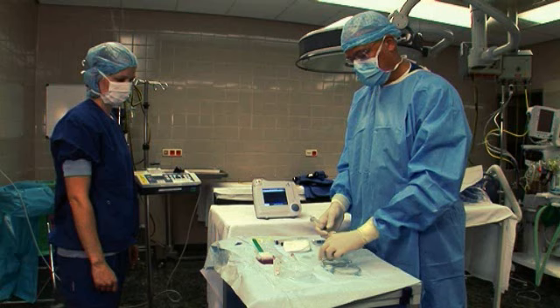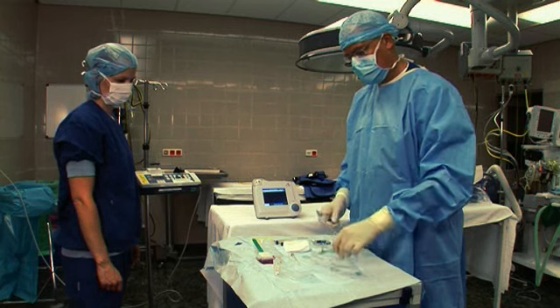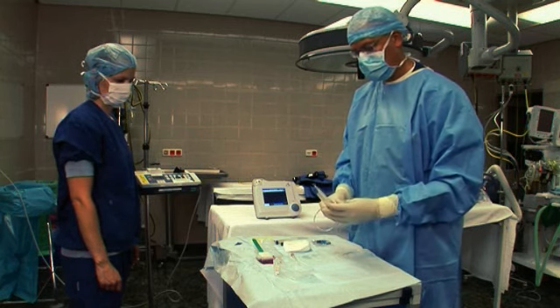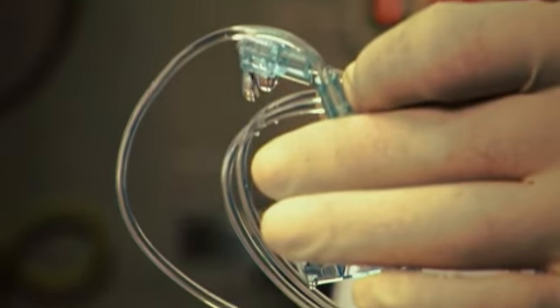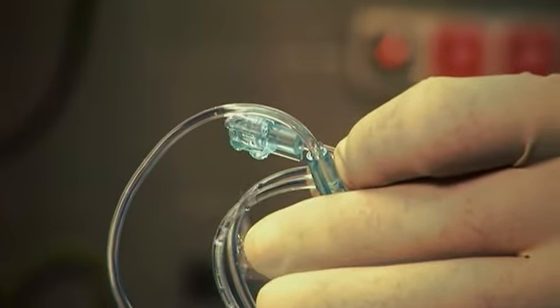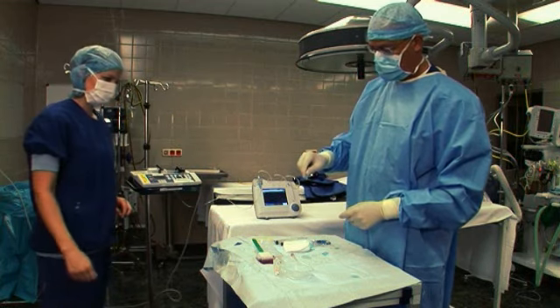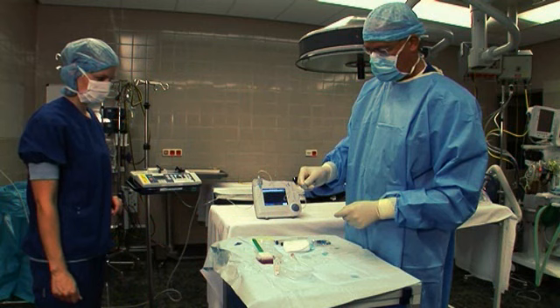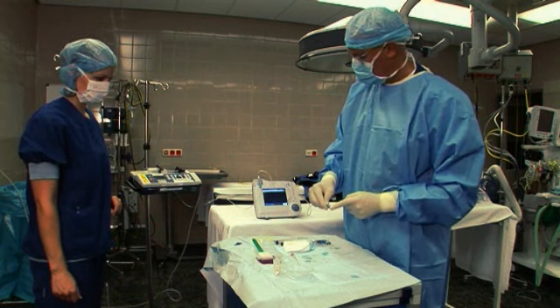The APAD measures the pressure in a disposable. This is a disposable extension tube between the epidural needle and the syringe. The disposable is flushed with sterile saline fluid. The pressure measurement signal is converted into an acoustic signal. The higher the pressure, the higher the tone pitch.